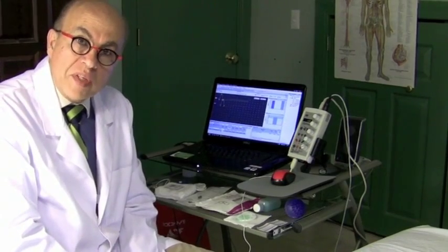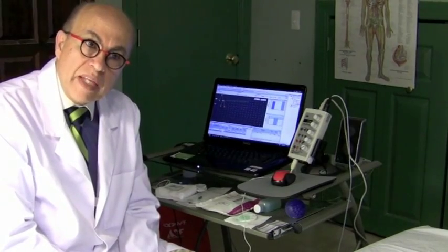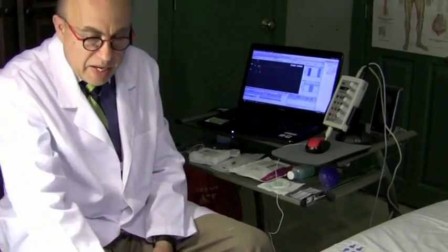Okay, we're done with the median motor study. Now we have one more study we need to do with the median, and that's the F wave. Let me tell you a little bit about the F wave. The F wave is a very, very small wave that actually comes from the spine, travels up from the wrist all the way to the spine and comes back to the muscle. Now let me tell you how that happens.